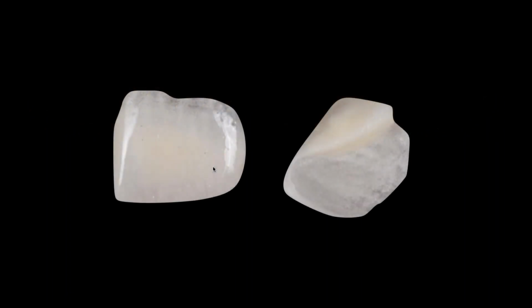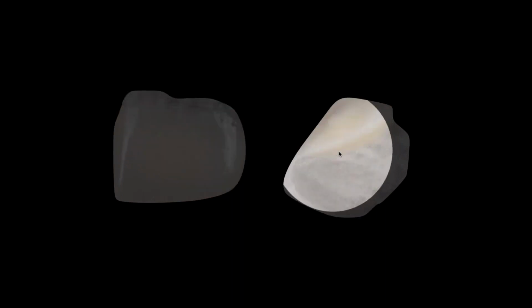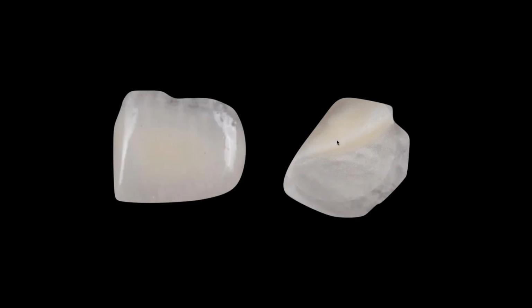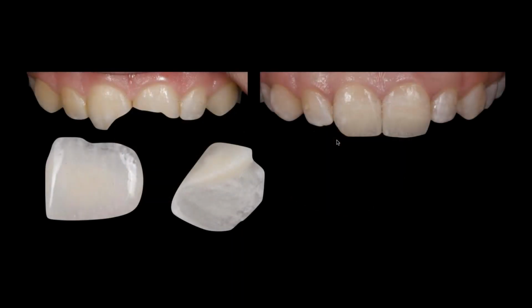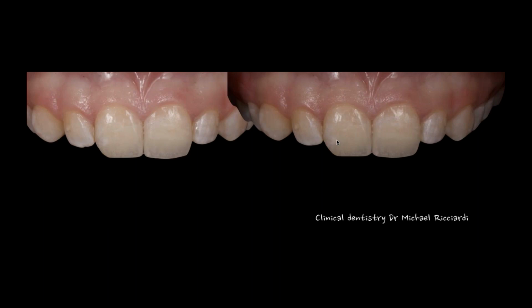And this is a perfect example to me of what I've been trying to say for these first few cases. Look at how thin the area is up around the cervical, up around where the tooth, the interface will meet, and look at how thick it is and yet opacified it is in the areas where I need it to be. And again, that's about me making that opacity from the inside, not from the outside. So we'll place those in the patient's mouth, we'll bond them in, and it worked out fine. Young girl, I'm sure we'll be restoring those again at some point, but for today, that worked great.